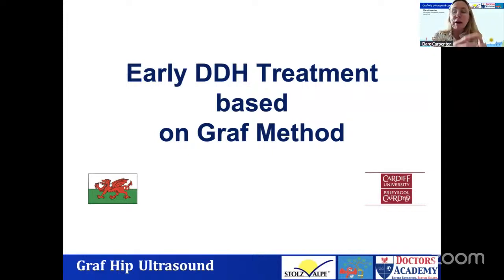So we talked about the merits of using ultrasound as a screening method in hip dysplasia. But another thing about the Graf method is now you can have a reproducible check on your treatment methodology. And I think, again, if you look at the worldwide literature on the early treatment of DDH, not late treatment, now, that's a whole host of controversy in itself.